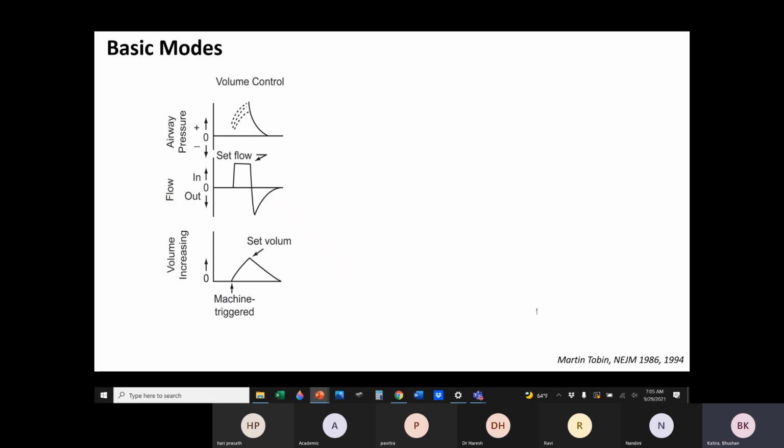All of this comes to 5 fundamental modes, and this is what one needs to know as basic modes. The rest of the things are derivations of it. The rest of the things are combinations of those. Those are not modes. Modes are these 5 fundamental things.